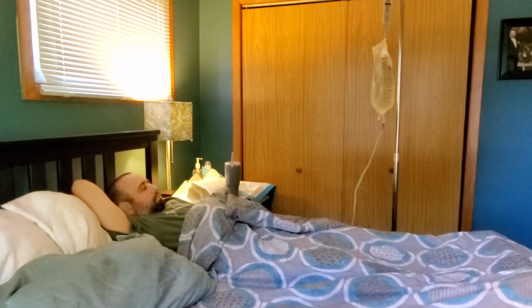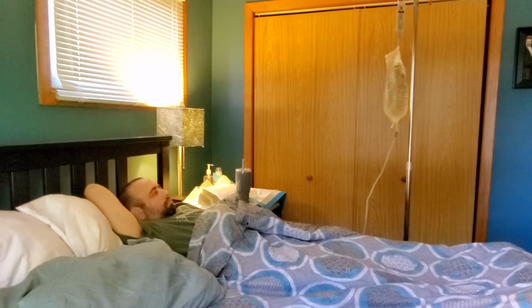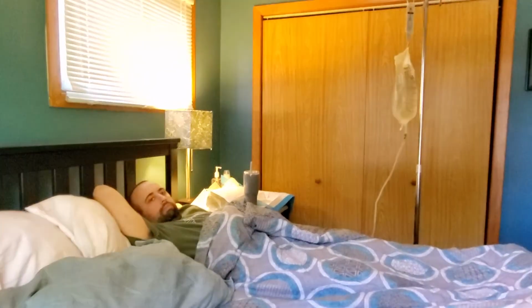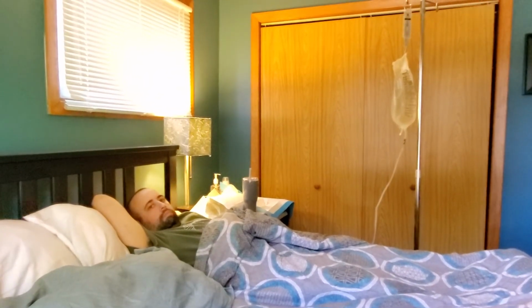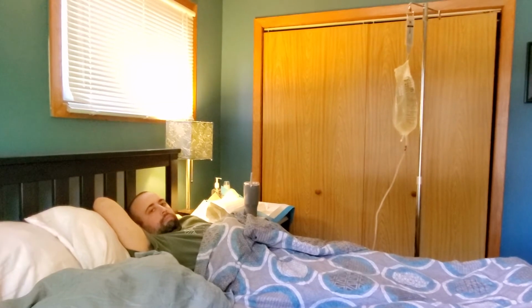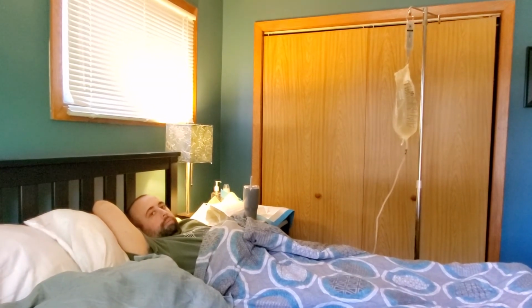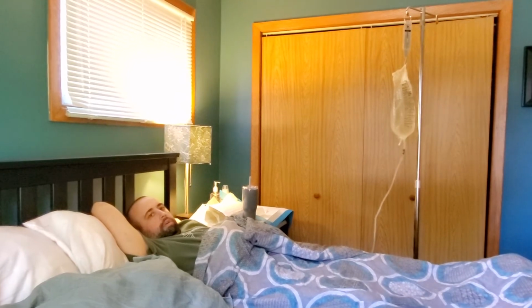Alright, so he is doing the fill right now, which takes about 15 minutes. And then once it's filled is what's called the dwell period, which is when the solution is actually in the peritoneum, and doing the work.